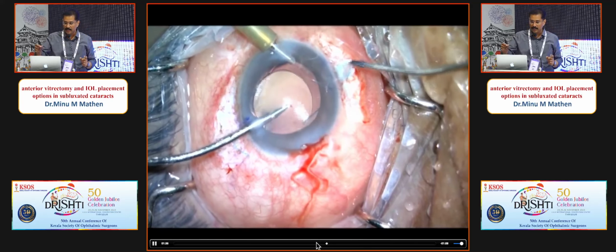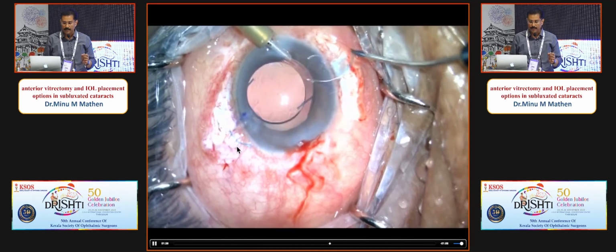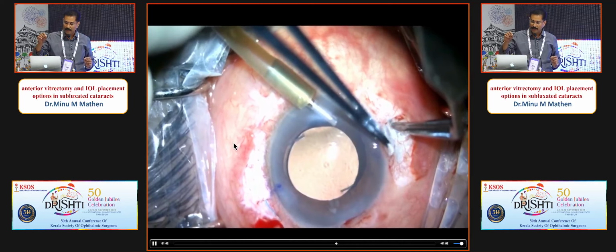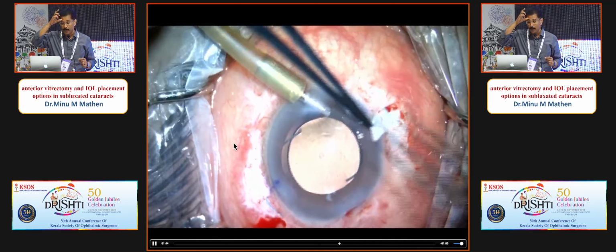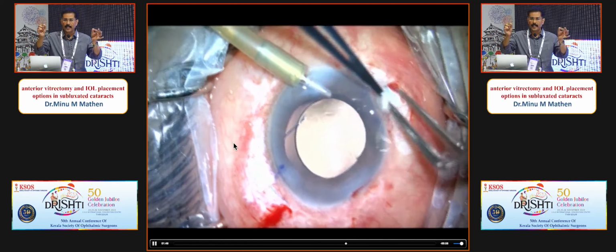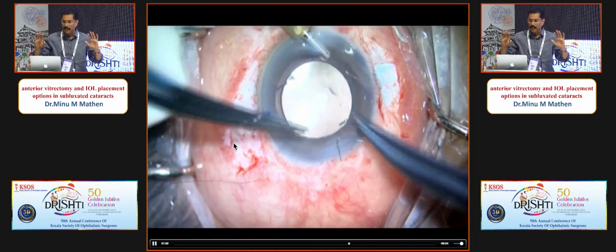And once it is taken out, then you loosen this silicone tip, and after bringing it out, I get it into the scleral pocket. I'll show that pocket next after this. And it is tucked on both sides. Tuck it, retuck, center it properly, and close.